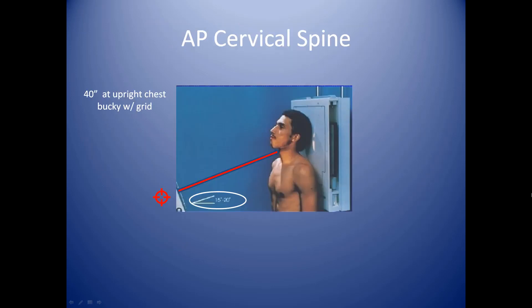For the AP cervical spine, you want to be at 40 inches at the upright chest bucky with a grid. This image has a flaw I'll explain in a moment. You want to center your crosshairs just above the patient's adam's apple and just below the chin. We are angling the tube 15 degrees — I would stick to 15 degrees because modern patients watch more TV and look at their phones, so neck angles have decreased and we're not seeing as many hyperlordotic patients.